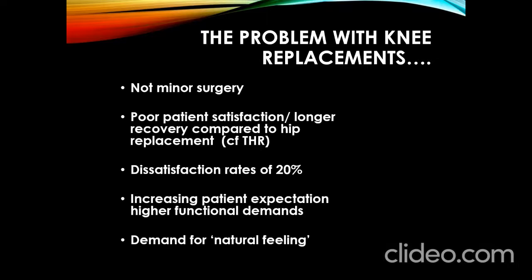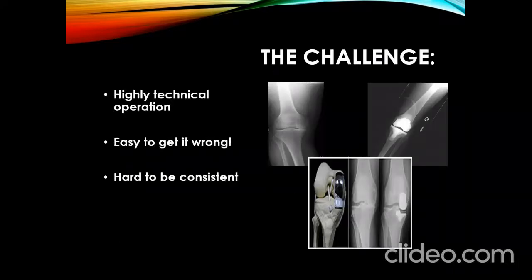We're seeing increasingly younger patients who want to be able to return to high levels of activities, skiing, tennis, and they have high expectations of what the knee replacement should achieve for them. There's this demand for a normal feeling or natural feeling knee. And the challenge for surgeons is that knee replacement is a highly technical operation. It's easy to get it wrong, and it's hard to be consistent, especially if you want to do a partial knee replacement, such as what you can see in the bottom picture.